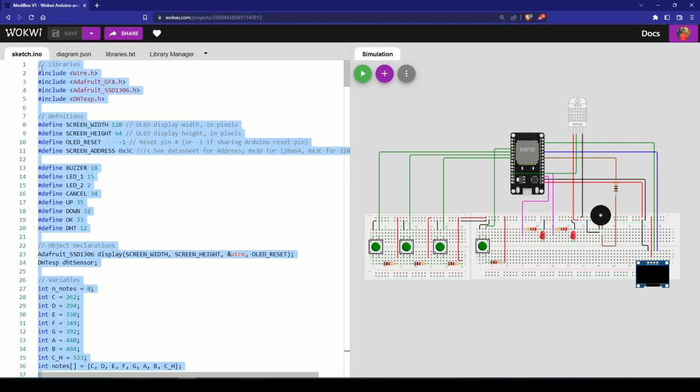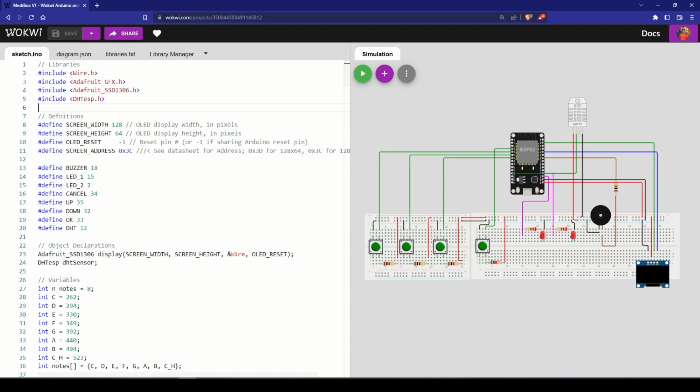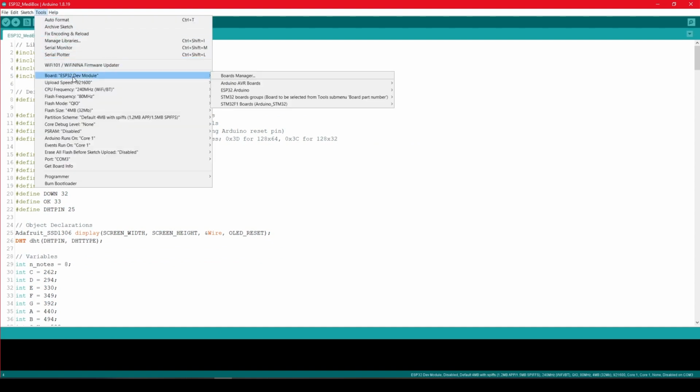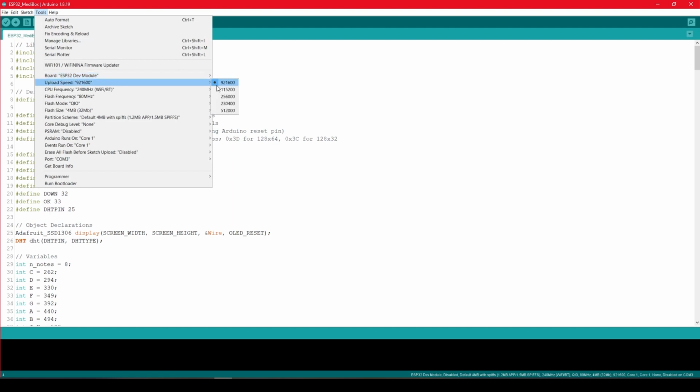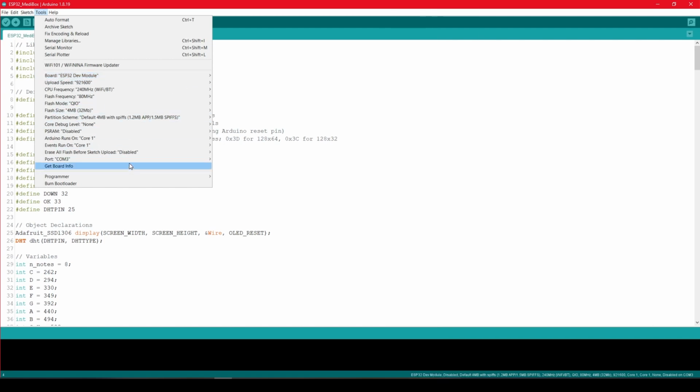First of all, I will copy the whole code into my Arduino IDE. Here I am using the Arduino 1.8.10 version. And I have installed the ESP32 board just like in the tutorial we showed you that week. I have also correctly selected my board and the COM port as well.